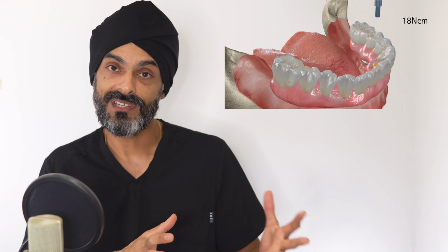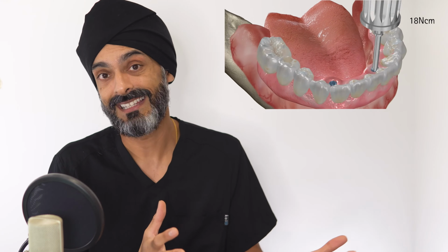However, the removable dentures are better in terms of cleaning. It's easier to take them out, give them a good clean, and click them back in. With these click-in dentures, there are foods which are going to dislodge them. It's not as solid as it looks in these video clips, because we've got fresh locators in position. They are really strong, but over time these will wear out and they might need replacing once a year, something like that. We call it servicing them, which has its own cost, but any of these solutions will have an ongoing servicing cost.